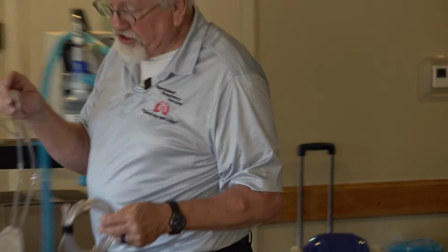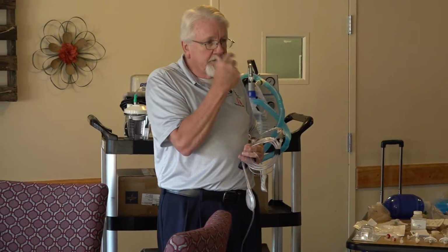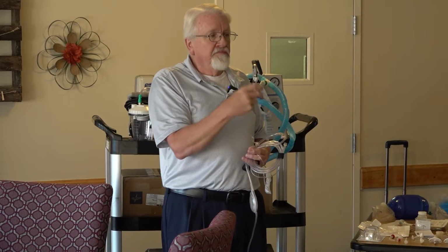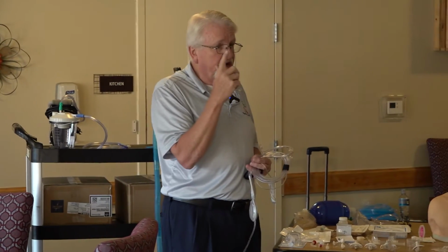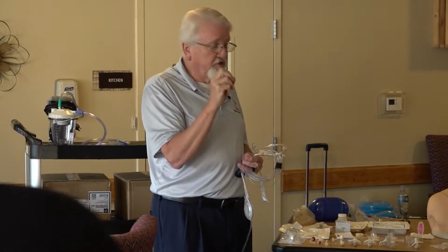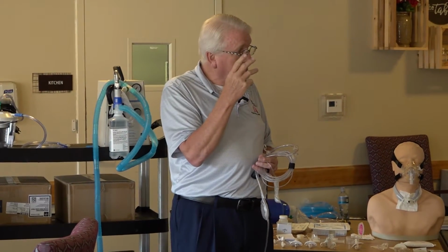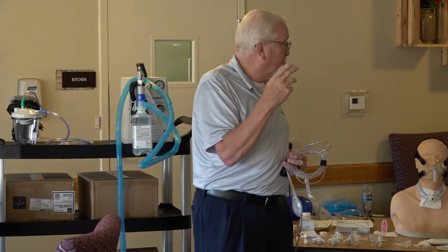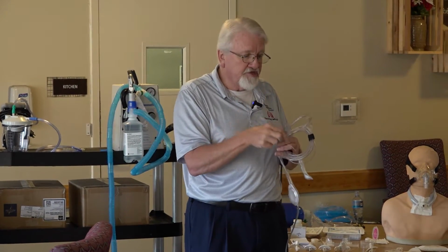Okay. Well, the principle is if you just have a regular nasal cannula in, and you inhale, besides the oxygen that you're getting from the nasal cannula, you're also entraining some air. And I'll give you a good example of entrainment here in just a second. So you're also entraining 21%, which means you're diluting the oxygen you're getting out of the nasal cannula.